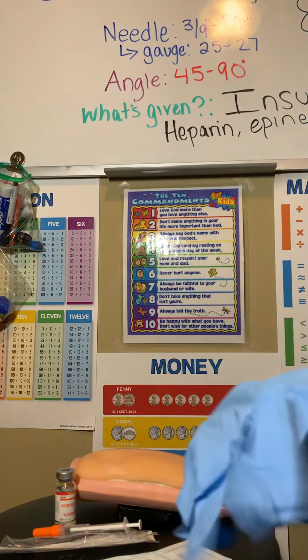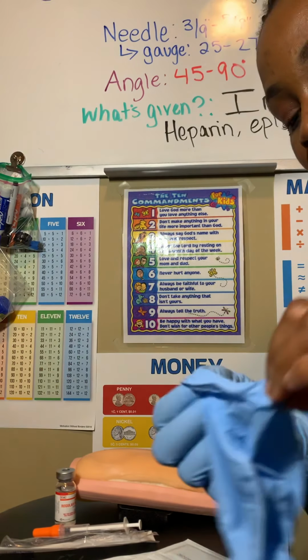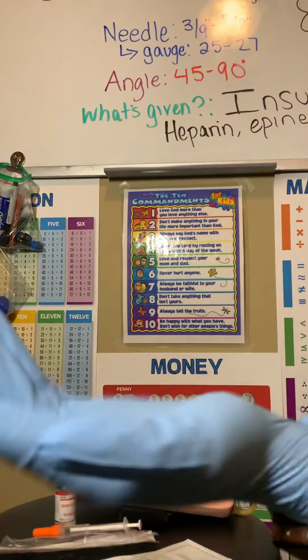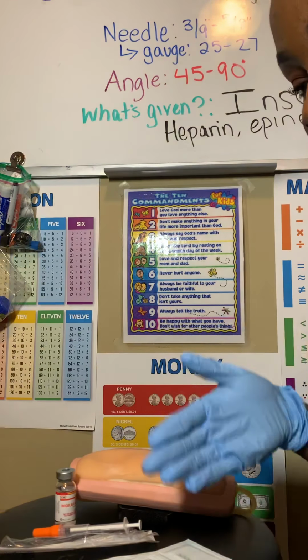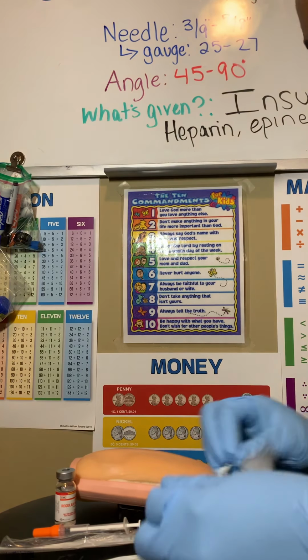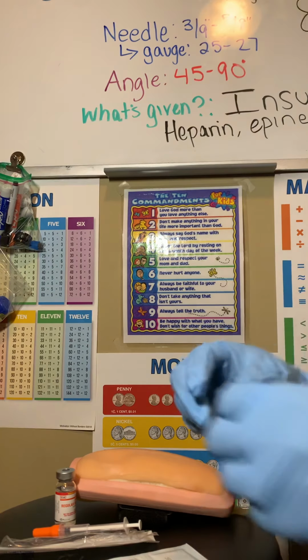Let me put on my gloves. Let me apply my gloves. And while I'm doing this, I want to mention, before you give insulin, some patients are on sliding scales or they have a standard dose, and I'll talk about that afterwards, okay? All right, and next, oops, that flew right out of my hand.